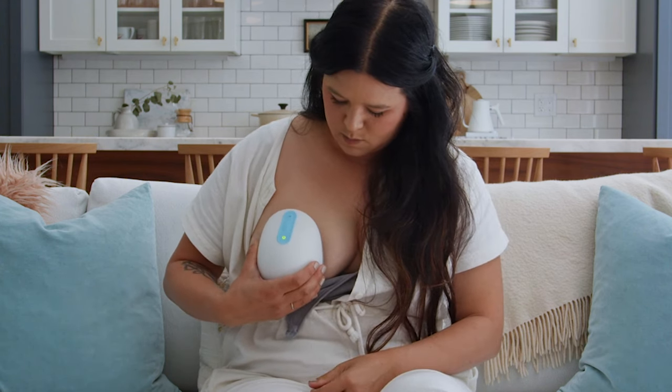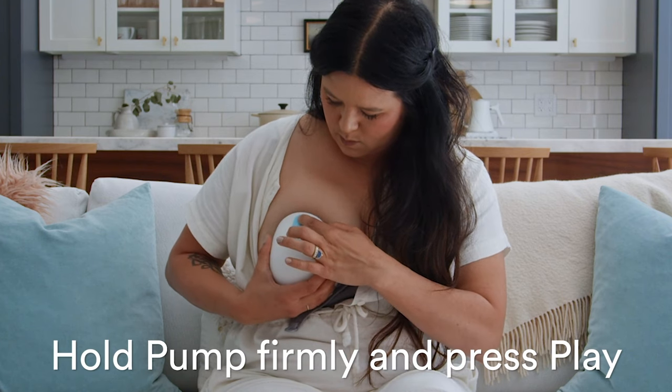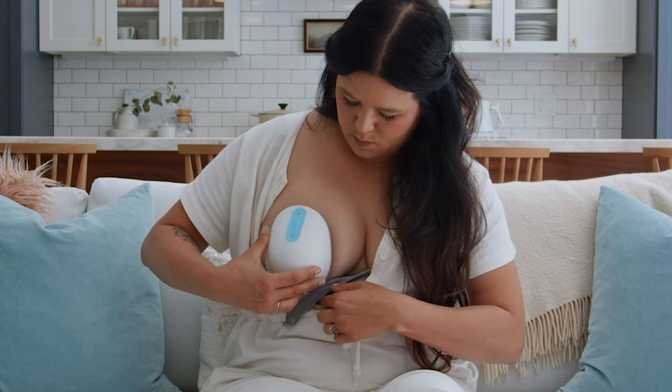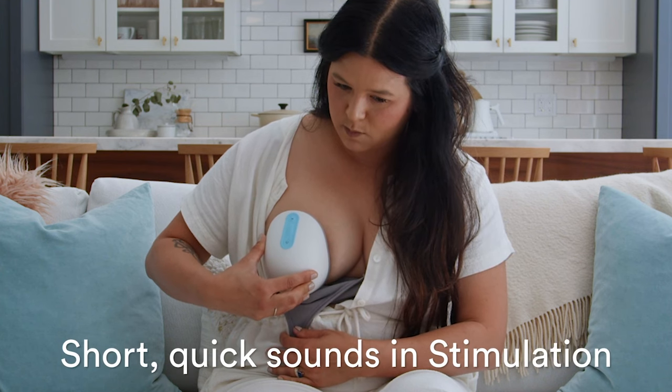When the pump is connected, hold the pump firmly to your breast and press play. When Willow is latching, you'll hear gulping sounds. Then Willow transitions to stimulation phase. You'll hear short, quick sounds like this.